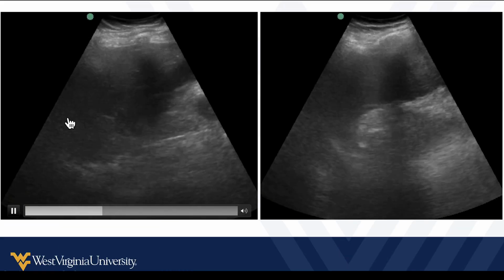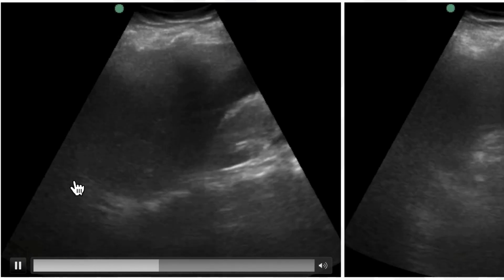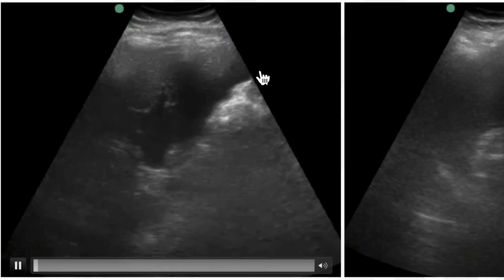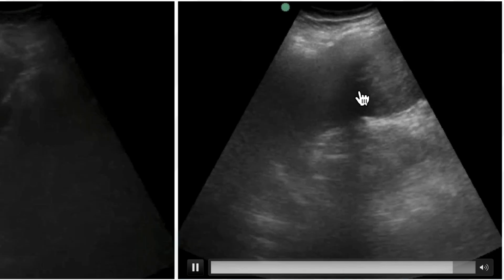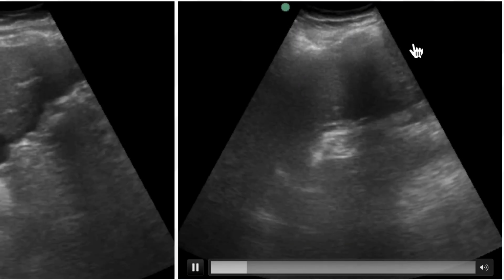But then as we get into the abdomen, we identify the diaphragm. There's no fluid above the diaphragm, but then we see pretty clearly and easily fluid in Morison's pouch. And then this looks like, I think this is the left side, where we see diaphragm, we don't see any fluid. We see the spleen, but it's poorly defined, and actually what we're seeing, some of this here is gray clot at the tip of the spleen.